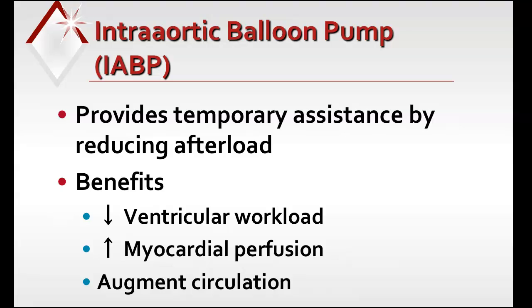So when would be some reasons why we would use this? Well, this would be great for unstable angina that drugs have failed with. It can be used as a short-term bridge to a heart transplantation. It could be used following an acute myocardial infarction, specifically with septal defects, cardiogenic shock, or refractory chest pain that just isn't getting any better. We could use this preoperatively, intraoperatively, or postoperatively for cardiac surgery. You see this a lot of times when patients have open heart surgery. Or any high-risk interventional cardiology procedure would be beneficial for this patient.